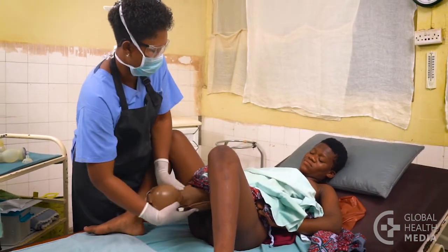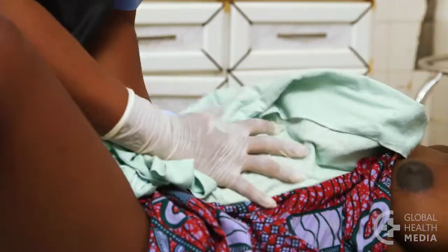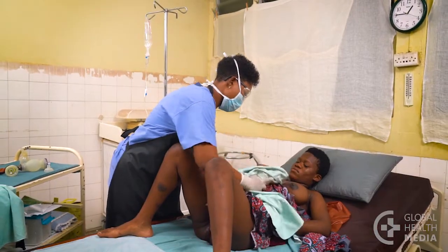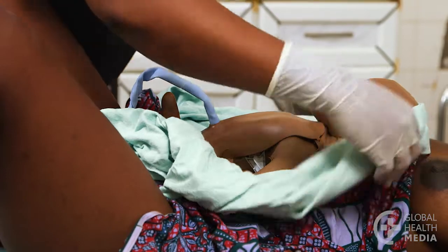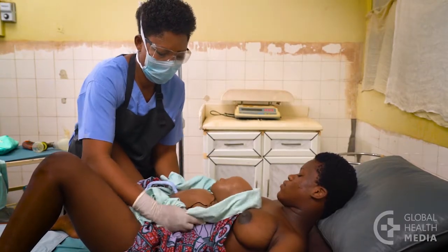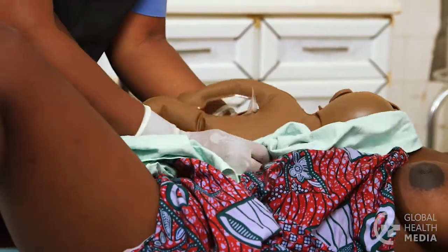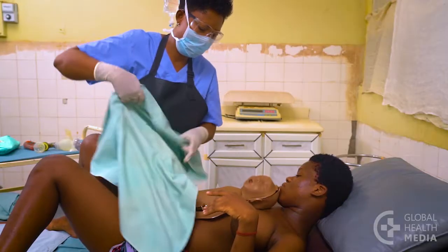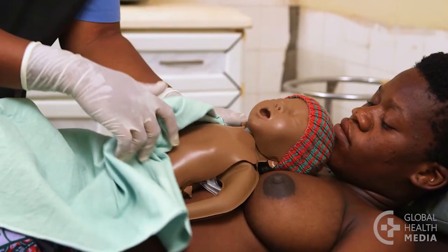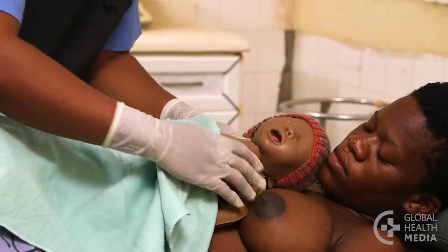Immediately after the birth, place the baby on the mother's abdomen and note the time of birth. You notice the baby hasn't cried — this is a warning sign. A crying baby is a breathing baby. Quickly and thoroughly dry the baby's head, body, arms, and legs. Turn the baby to her side and dry her back; this helps stimulate the baby to breathe. Then change to a dry cloth and cover the baby's head. Observe the baby's chest closely — the baby is not breathing. Now start the steps to help her breathe.